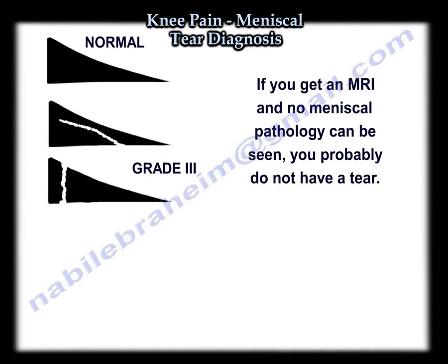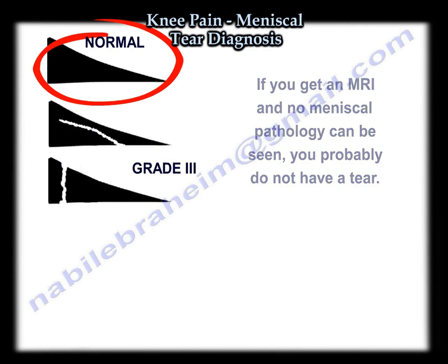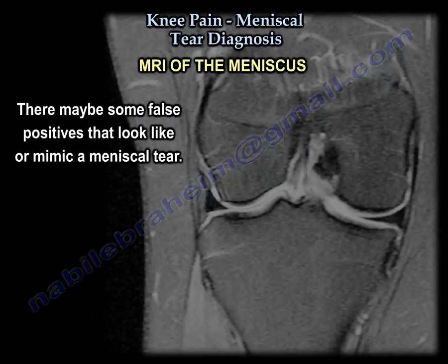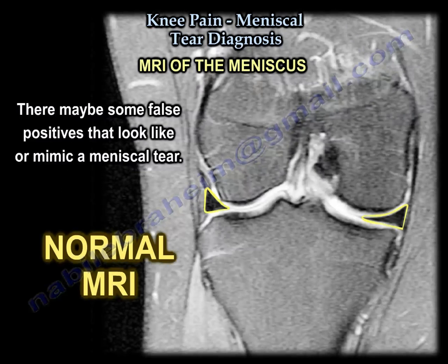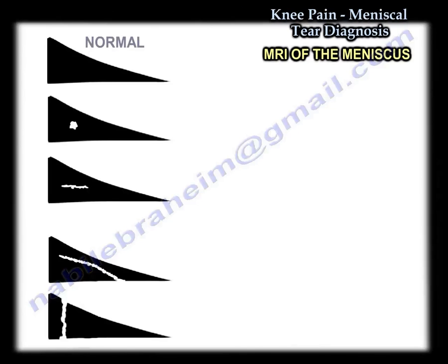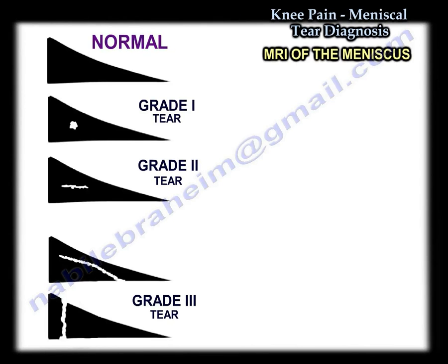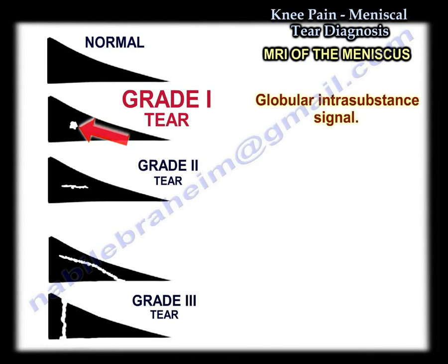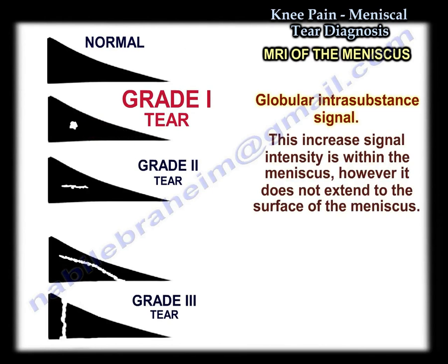If you have an MRI with no meniscal pathology, you probably don't have a tear. However, there might be some false positives that are not actually a tear but look like one. This is a normal meniscus, and this is grade one — in grade one you see a globular intrasubstance signal. This increased signal intensity is within the meniscus but does not extend to the surface.